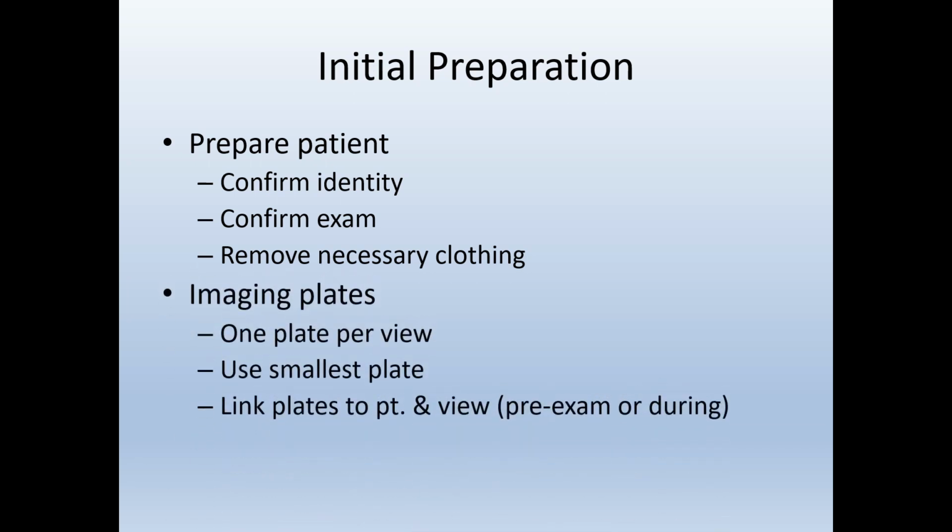While the patient is changing, this is a good time to gather the imaging plates necessary to complete the exam. One plate per view. With computerized radiography, it is not necessary to put multiple views on a single plate. This was done in the film screen era to save money, so select one plate per view.